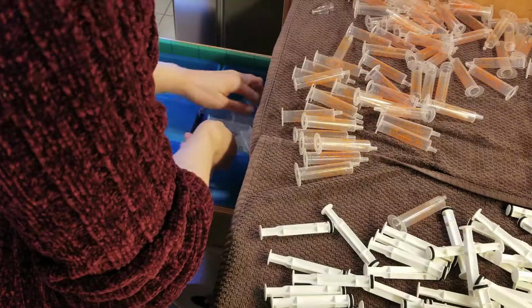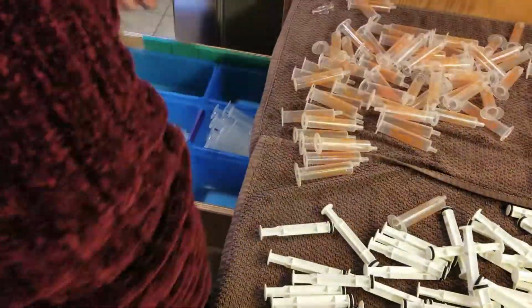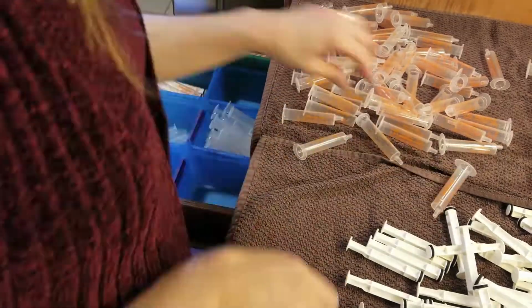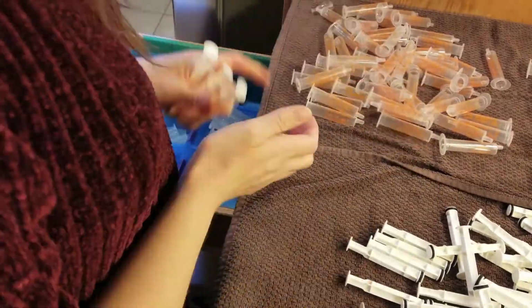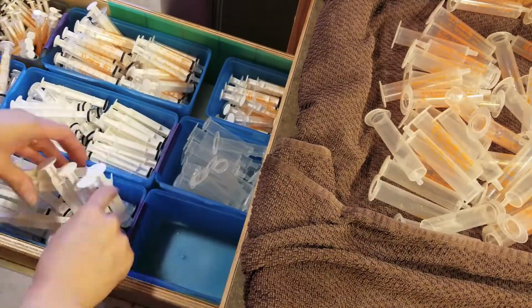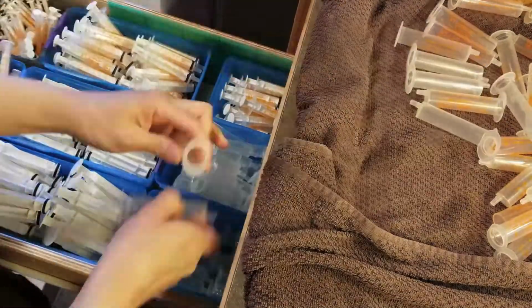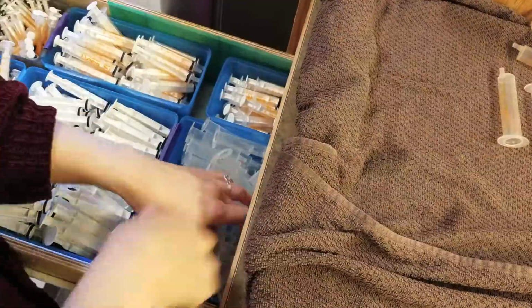So what I'm doing right now is I'm just putting the syringes into their corresponding size bin. Takes a bit of work. You can see I have quite a lot of syringes in that drawer. And yeah, the larger syringes don't have markings because those are just for pills.